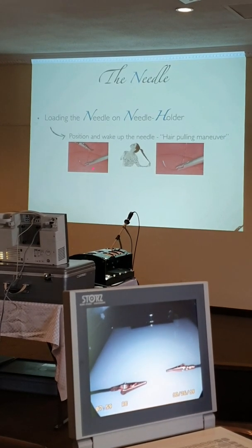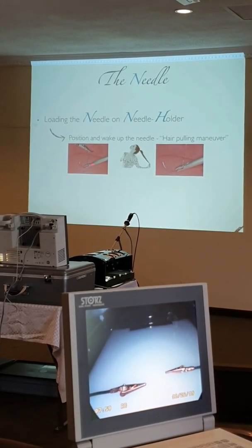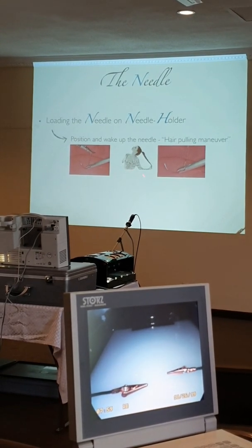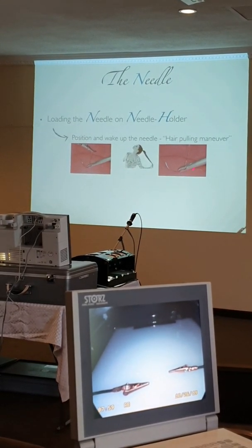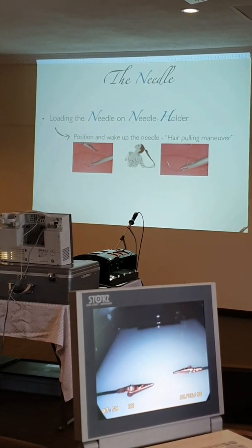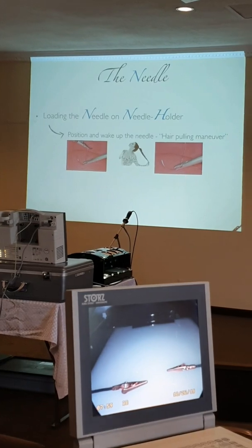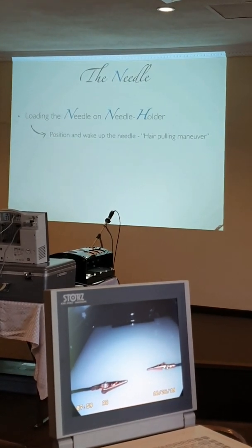Look here, it's not woken up. When you make the hair pulling maneuver, the needle stays in a good position, and now you can go into the suturing.